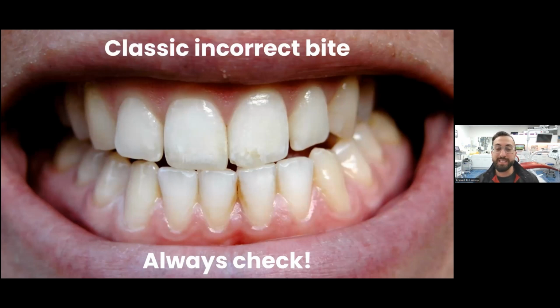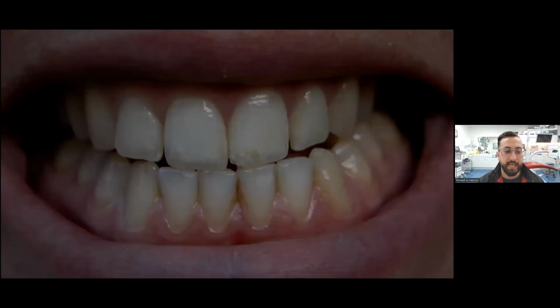So the point is always check, always get the patient to bite down on their back teeth and make sure, and this is the terminology I like to use with my patients, bite on your back teeth and bite very hard. And that's when I take a scan.